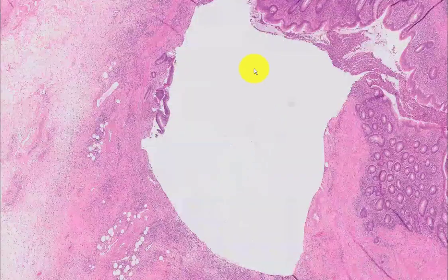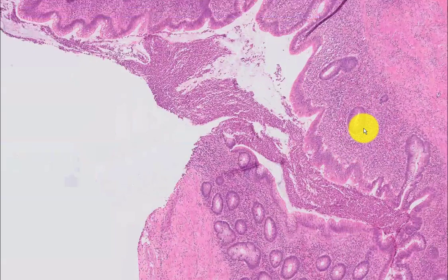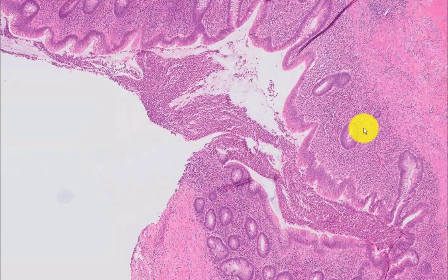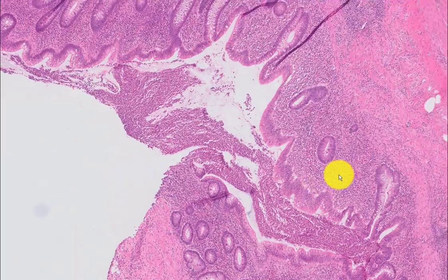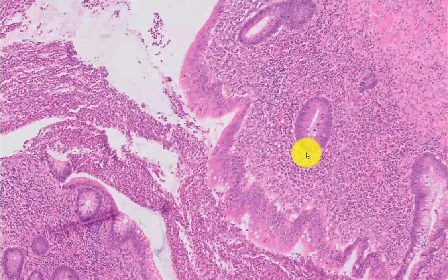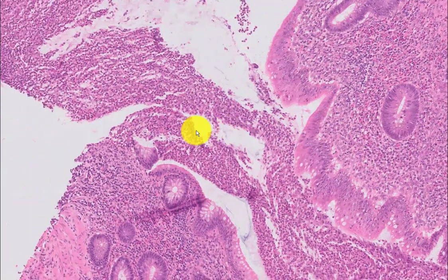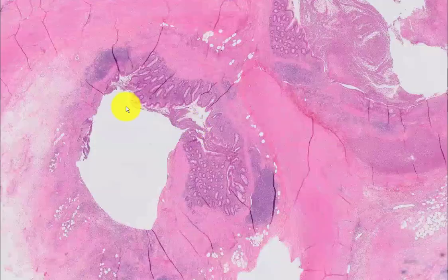Here's the lumen, right down here. Here is the mucosa of the appendix — it looks like every other appendiceal mucosa. There is a substantial amount of inflammation. Here are the crypts, and there seems to be acute inflammation in the lumen of the appendix.